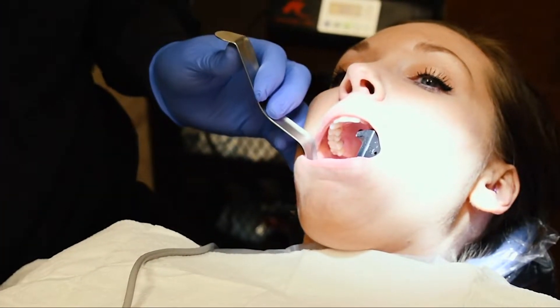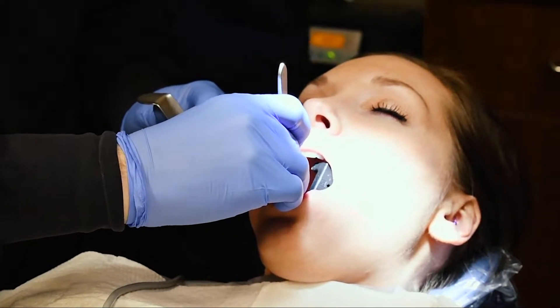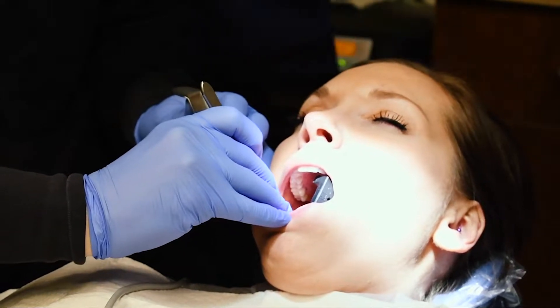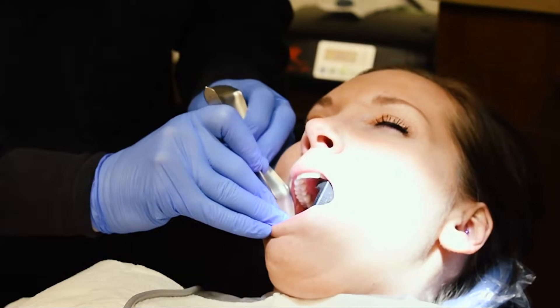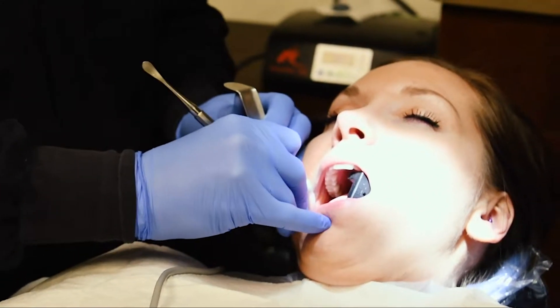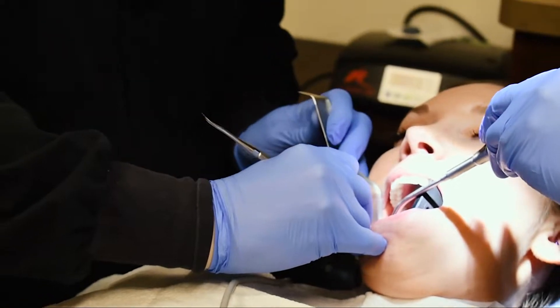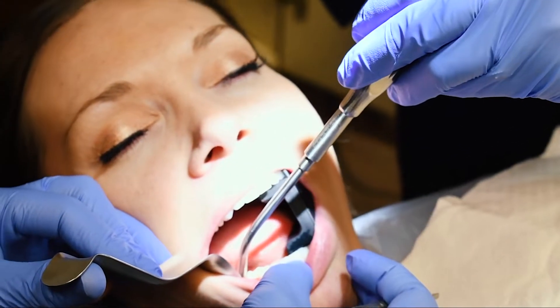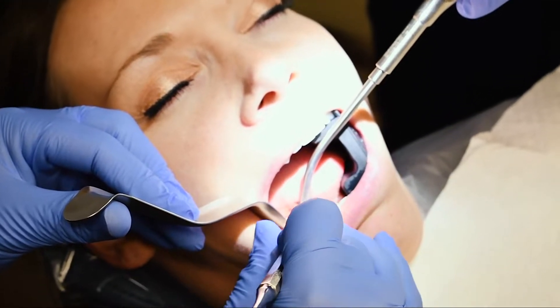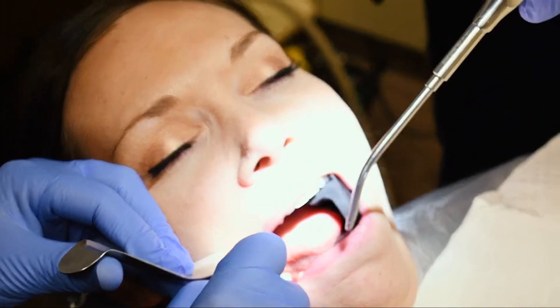So we're just coming out to the number 30 site — a little pressure here. Should be nothing more than just a little pushing, a little pressure. Feels weird — it's kind of a strange mental game. I'm raising a little flap here right now just so I can see this area nicely. I want to know the limits all the way around of where everything sits.